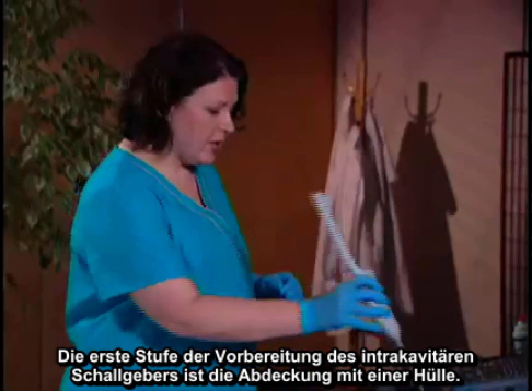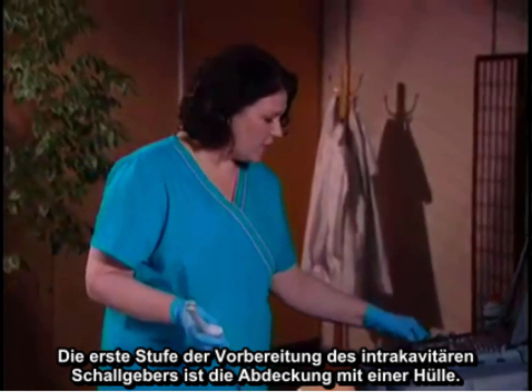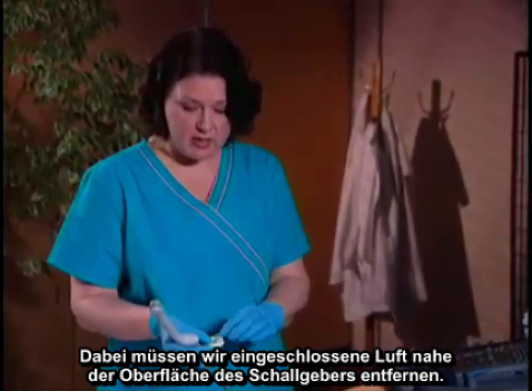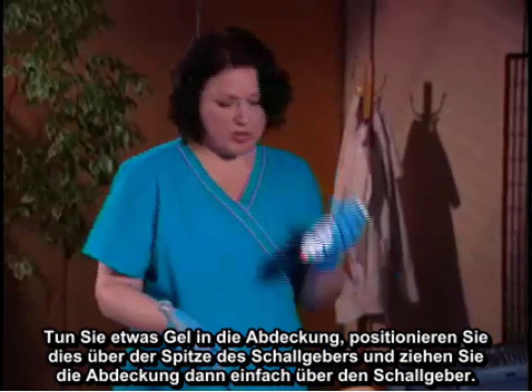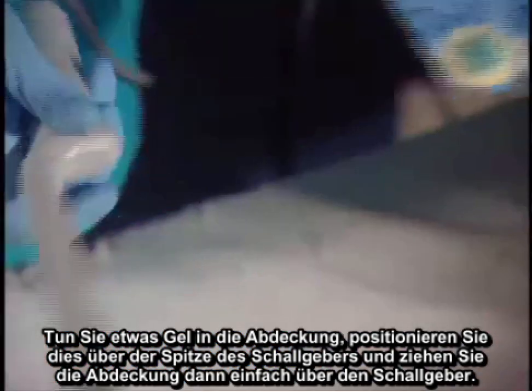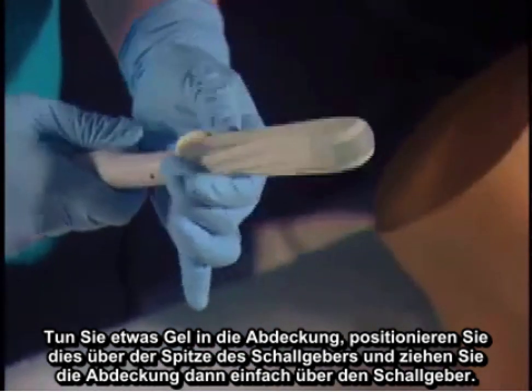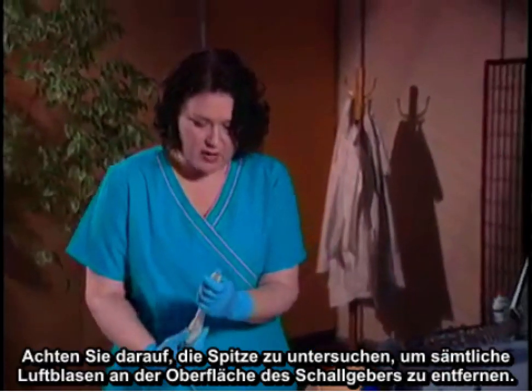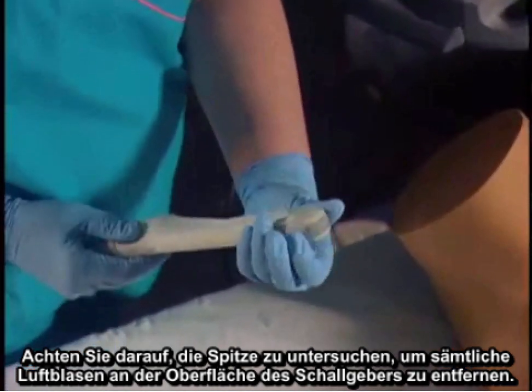The first stage of prep for the intercavitary transducer is that we need to cover it with a sheath. We need to remove any air gaps inside the sheath next to the transducer face. We'll put a little bit of gel inside the cover, position that over the tip of the transducer, pull the covering down over the transducer and handle for good coverage, then examine the tip to eliminate any air bubbles covering the transducer face.